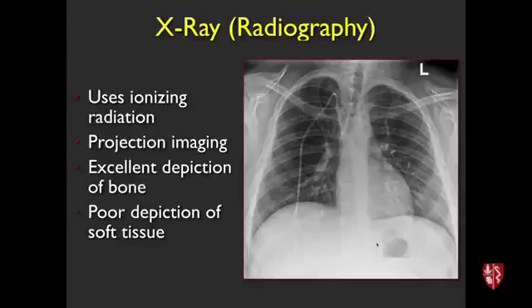It's widely available throughout the world. Even at Levi's Stadium, we have an X-ray machine, and looking at bones, it's really useful for looking at high contrast structures. It's limited because it's a projection technique. It's taking 3D anatomy and just projecting it onto a two-dimensional surface, and it doesn't really depict soft tissue that well. If you have something like lung versus abdomen, that's a lot of contrast there, or you see the bones real well, but within the abdomen, you don't see much, so that's a limitation.